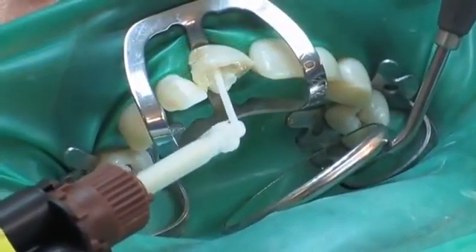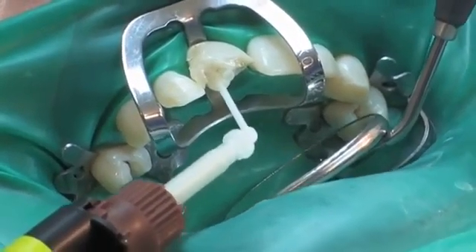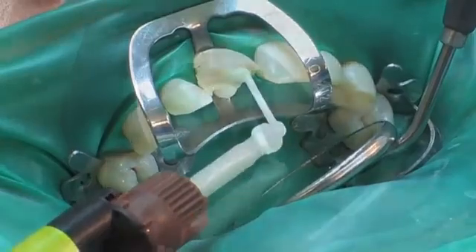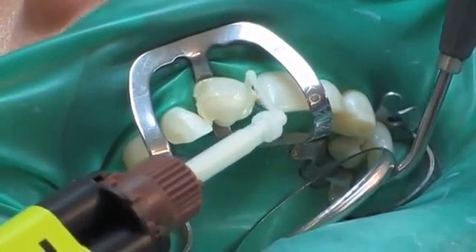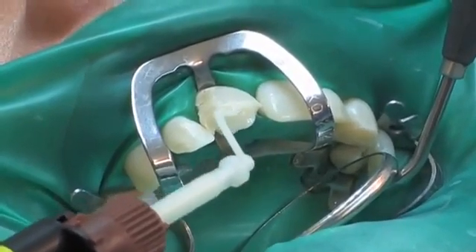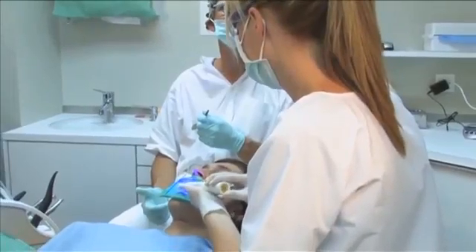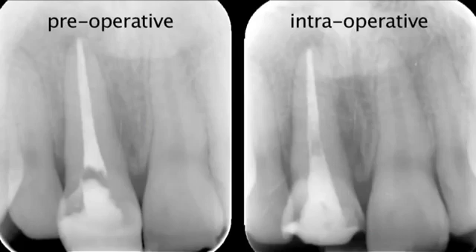Without any further delay, the core build-up can be fabricated. The non-slumping consistency of Paracore allows for free-hand modelling of the core build-up and direct application onto the prepared tooth structure and retention head of the root canal post. The core build-up is light cured afterwards for 20 seconds per side. An intraoperative radiograph is taken showing the glass fibre post cemented in place.